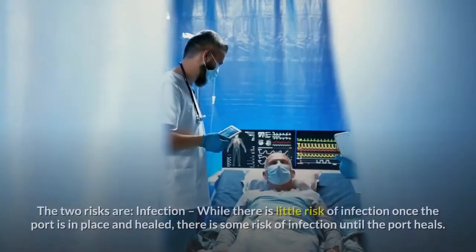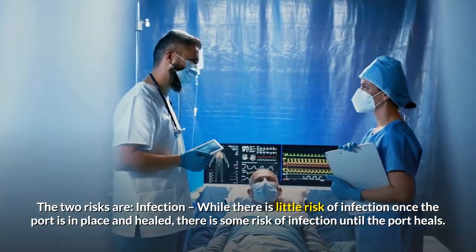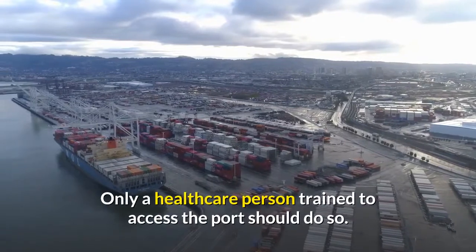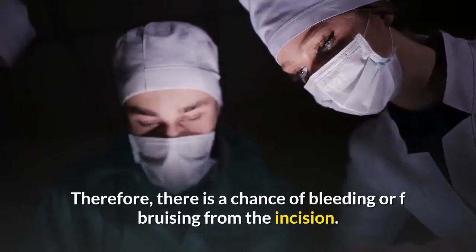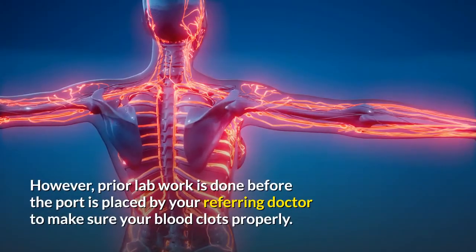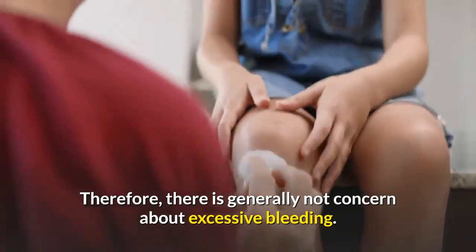What are the risks? The two risks are infection and bleeding. While there is little risk of infection once the port is in place and healed, there is some risk of infection until the port heals. The other time the port is at risk of infection is when the port is being accessed or used. Only a healthcare person trained to access the port should do so. To insert the device, a small incision is made in the chest skin, so there is a chance of bleeding or bruising from the incision. However, prior lab work is done before the port is placed to make sure your blood clots properly, so there is generally not concern about excessive bleeding.